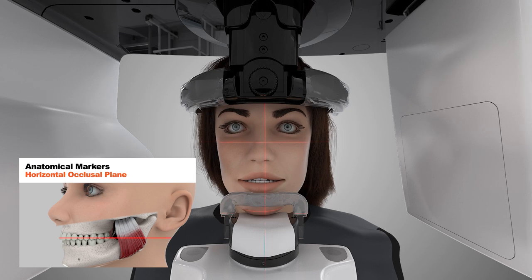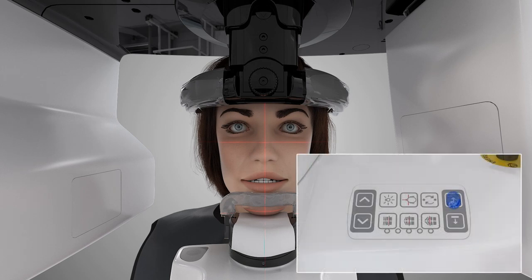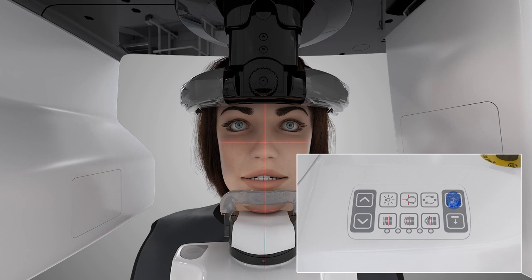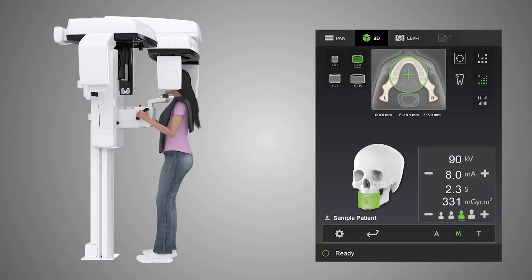Ensure that the patient's occlusal plane is horizontal. Manually move the patient's head to compensate. Adjust unit height and chin support height to ensure the area of interest is between the top and bottom FOV laser light lines. Close the temple supports by rotating the adjustment knob clockwise. If you would like to show the patient how the rotating unit works or to ensure proper clearance of the patient prior to exposure, use the test mode by pressing the test icon on the touch screen.